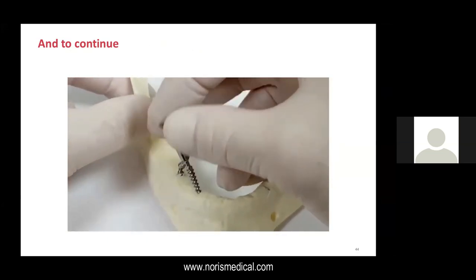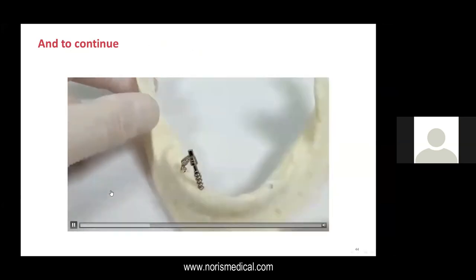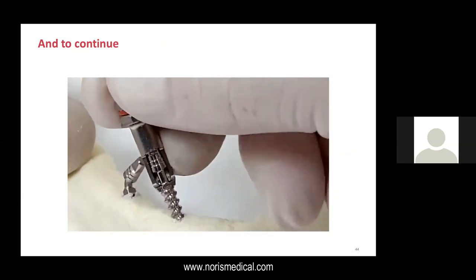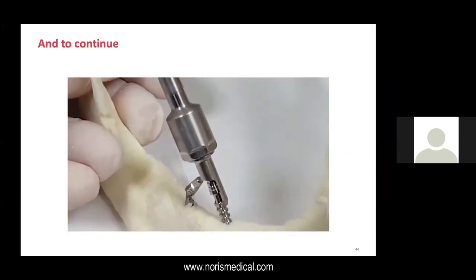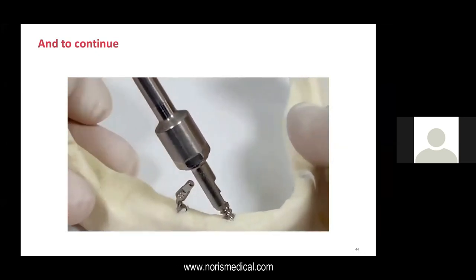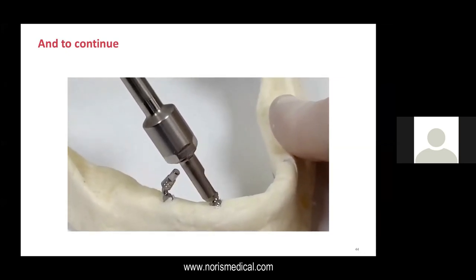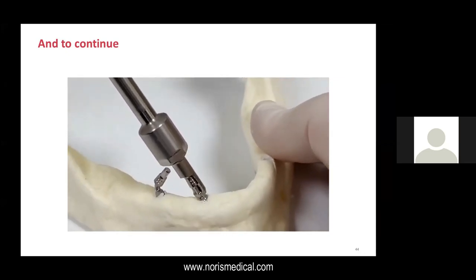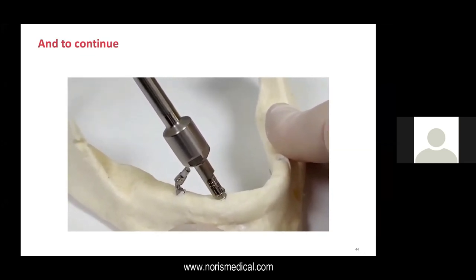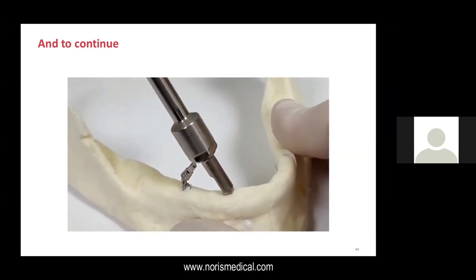And here you can see also that the insertion of the implant, by the way, the threading of the implant has changed a little bit. Here you can see again the hex of the implant. You should hear a click when it goes in, and then very, very easily the implant goes in. When we work with this key, I know that no pressure is actually applied on the bone during the bending process of the implant.